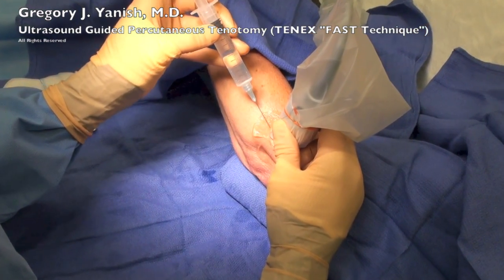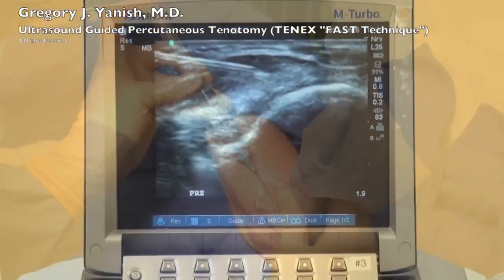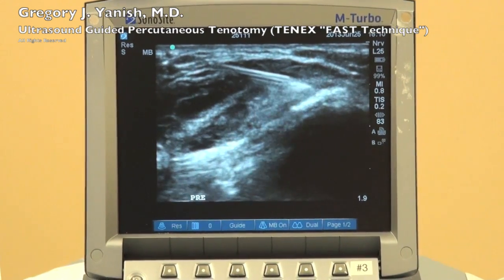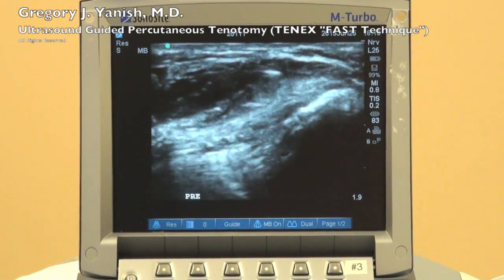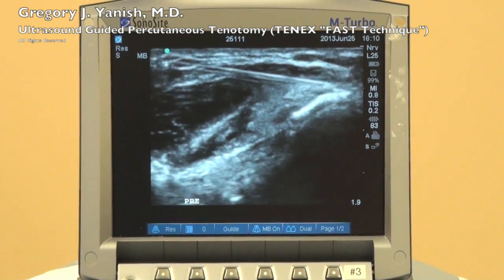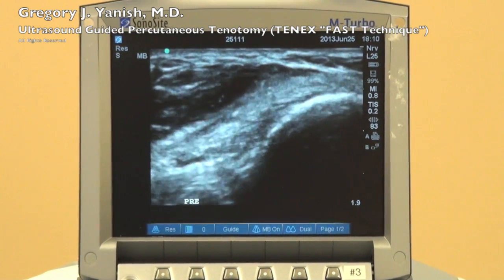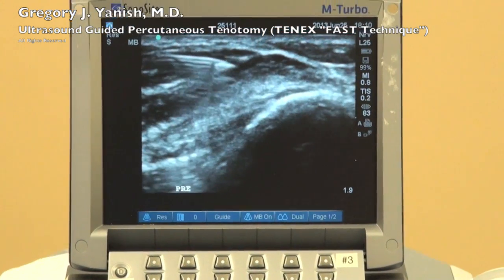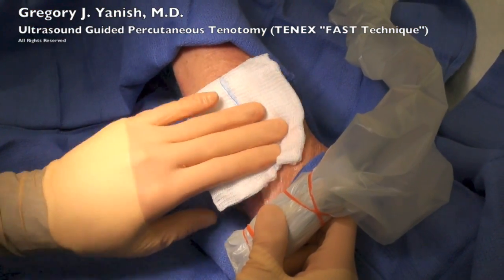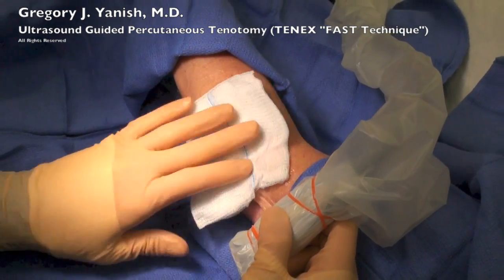This is the installation of the local anesthetic. The patient is actually awake and is not under any sedation. You can see the needle on my screen entering the common extensor origin and the subcutaneous tissue overlying it. Doing this under ultrasound allows me to place the medication immediately into the area that I'll be working on, as well as use less medication. I like to rub this in, as it allows me to have a little extra time for the medication to take effect, as well as spread out some of the fluid that I've just injected.